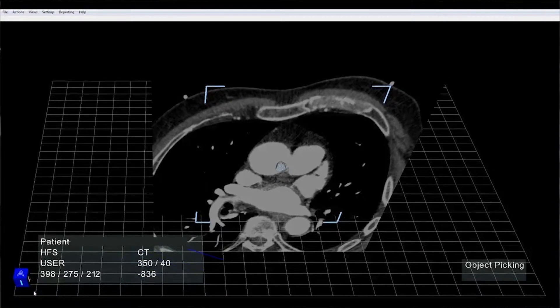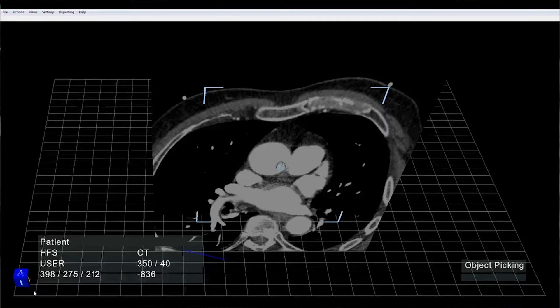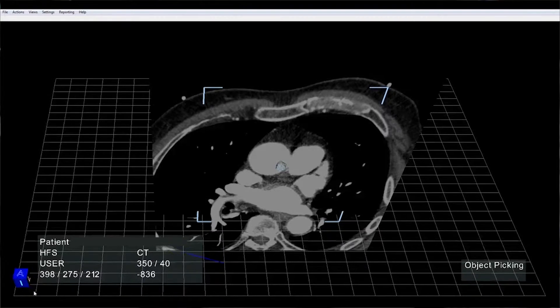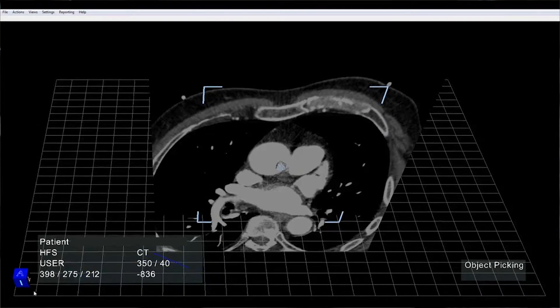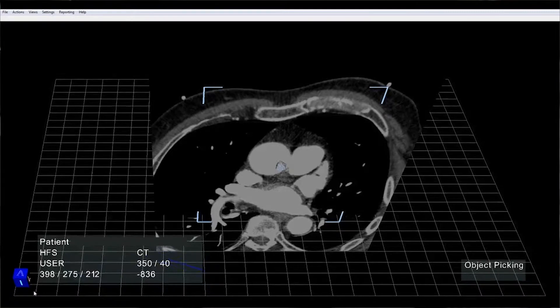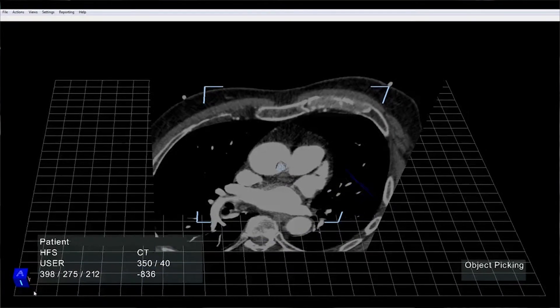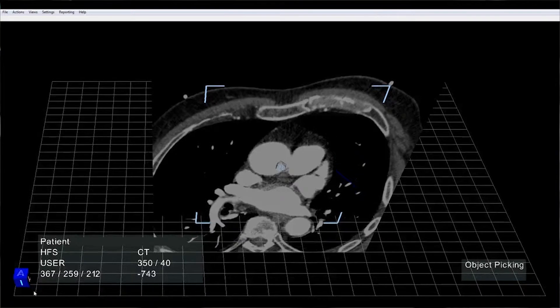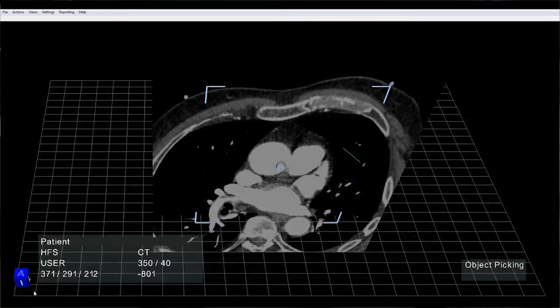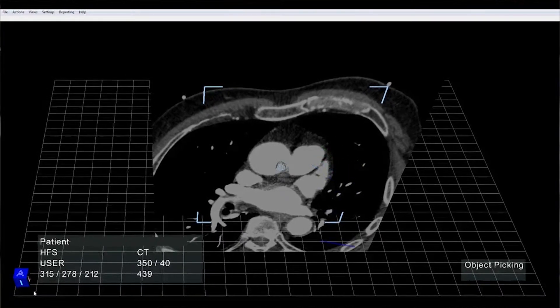Next to it, you'll see an information panel, which is going to give you information on the CT data set that you loaded: patient name, patient position, imaging modality, window level, voxel indices of whatever voxel you're hovering on, and the density value or Hounsfield value of your CT data.